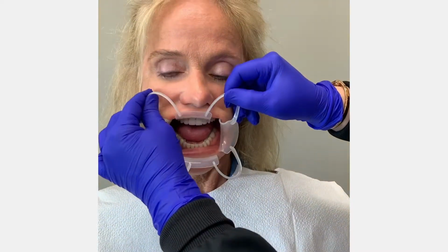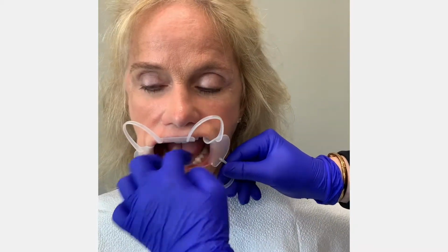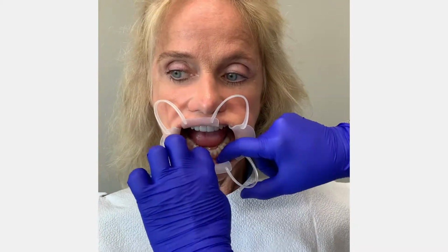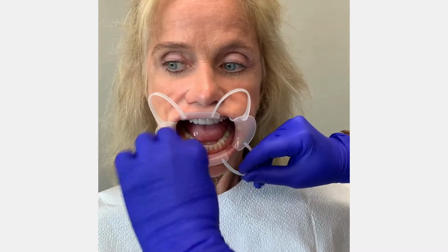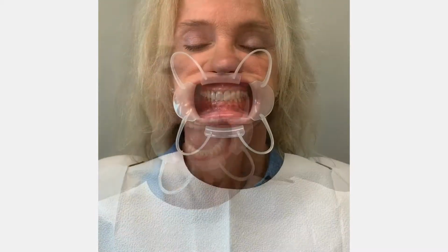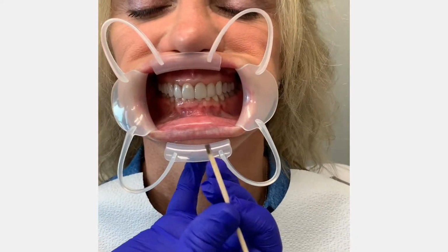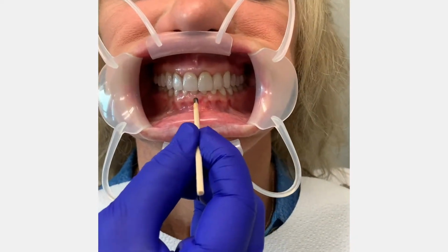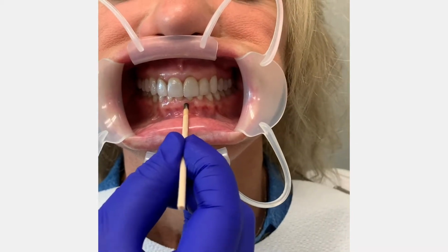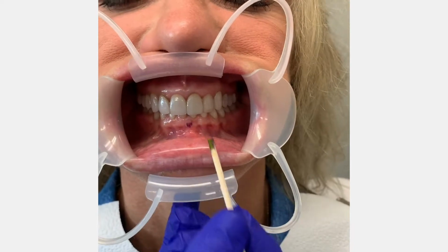I like to use cheek retractors for this next step, but they are certainly not mandatory. You will need to mark the midlines of the patient's face in centric occlusion, and a Dr. Thompson's marker works very well for this. Cheek retractors make it easier for me to discern the midline. With Mary, you can see the midline of the upper centrals is in line with the facial midline, so I will not need to mark anything for the upper. The lower, however, is not, so I will mark that with a Dr. Thompson's marker.